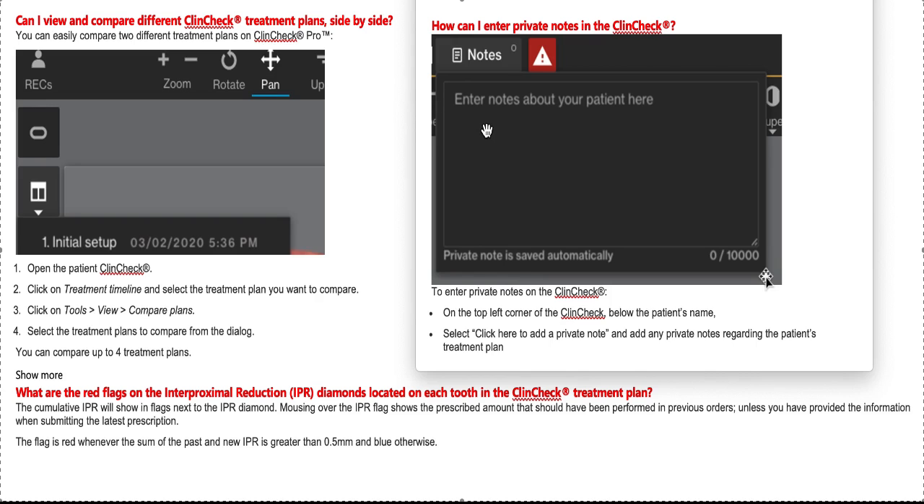The notes feature is really awesome. Lastly, keep an eye on the red flags on the IPR diamonds — that's super important, especially in your revisions and refinements. You need to know how much previous IPR was done. Remember, that's just based on your treatment plan — if the patient has had Invisalign in the past, it's not going to be on there. So as always, you need to take x-rays and think before you prescribe IPR.